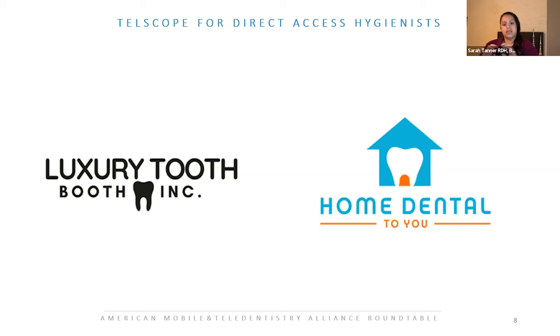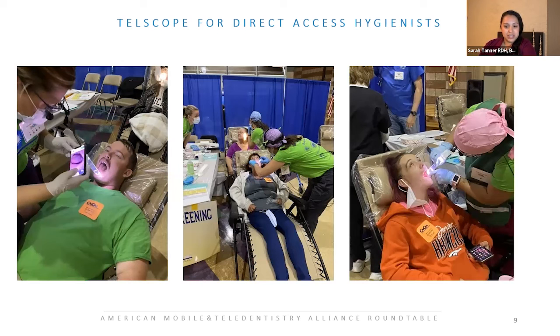My first experience, so Teledentix has been one thing, and then I had a separate experience with TelScope at COMOM, that's Colorado Mission of Mercy, where we saw 650 patients and they receive oral health care services at no cost to them. I happened to work with Susan Cotton and I met Mike there. And Mike was like, hey, I've got a new gadget for you to use while you're here. And I was like, sweet, that's awesome. So the guidance of Susan Cotton, her expertise in oral cancer is impeccable. So I was thrilled to dive in there, learn from her, get firsthand experiences.